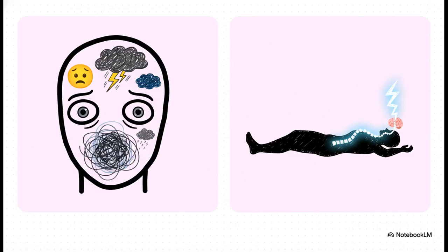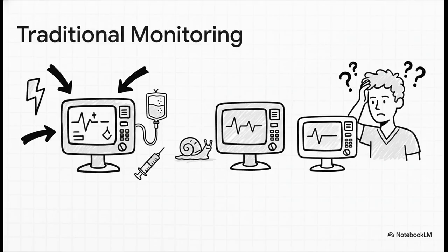That's our target. And this is where our old school tools kind of fall short, you know? A high heart rate, a jump in blood pressure. There are classic red flags, sure, but they are so nonspecific. Is it nociception? Is the patient a little light? Are they dry? Is it a drug effect? And on top of all that, they're lagging indicators. By the time that heart rate starts to climb, that whole stress response is already well underway. It puts us in this reactive, subjective spot, which leads to huge differences in how we dose our analgesics.